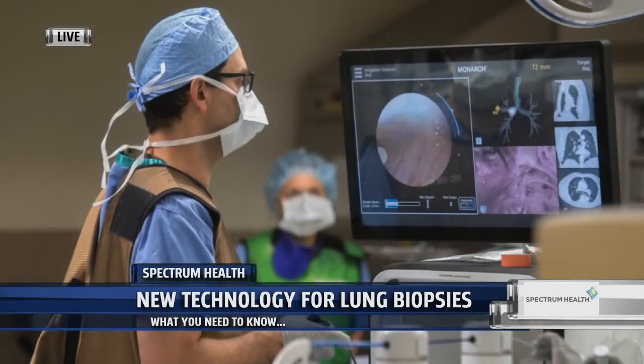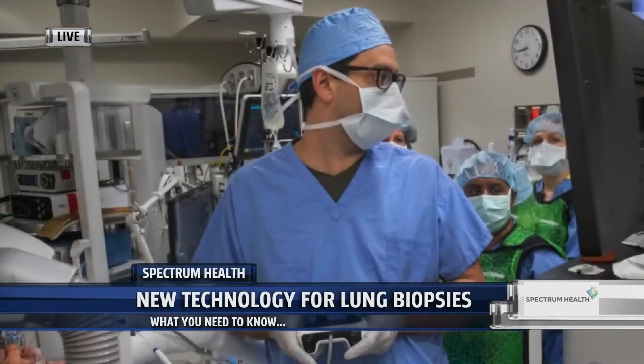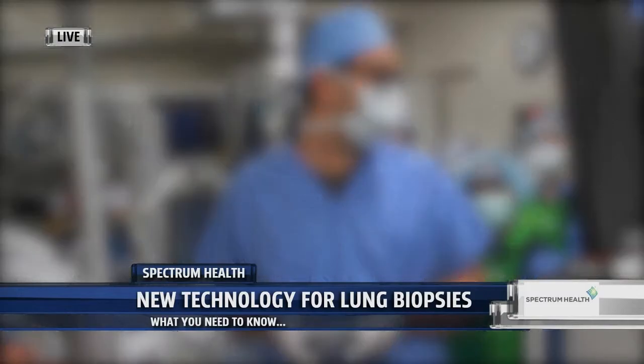And Dr. Cumbo-Nacheli, tell us a little bit more about specifically how this technology is going to work, more in layman's terms for everyone. Oh, absolutely. I want you to think about the lungs as being a sort of a tree. There's a major air pipe called the trachea, and then it starts dividing into very small branches to leaves. A lung nodule is essentially one leaf that we don't know what's going on. So this technology essentially was developed in order to reach that very high end of the tree and be able to pluck this out. And we do this combining robotic technology with a lot of precision, a lot of accuracy. We see all the way up there where that little pesky leaf is.